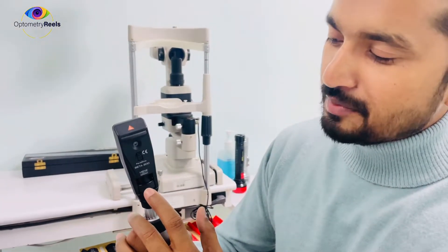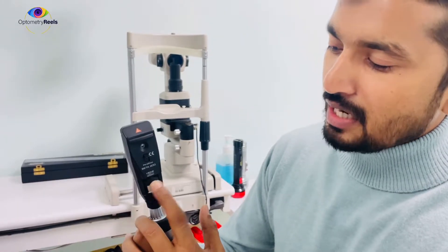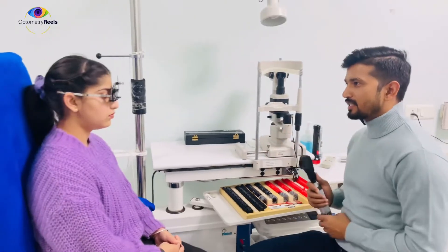Right now what you are seeing — the sleeve down — it will give a plain mirror effect. The moment you put it up, it will be a concave mirror effect. So I am going to perform this test using the plain mirror effect. Let's see what we are getting on her eyes.